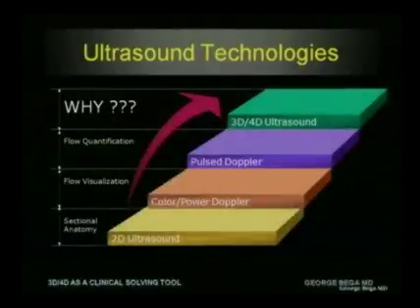First, everybody has been familiar with the fact that 3D ultrasound is a relatively new technology. We've had 2D ultrasound for years now. In the 80s, color and power Doppler as well as pulse Doppler were added to our normal clinical tools. Then recently 3D, 4D ultrasound have been increasingly used and contemplated to be used in clinical practice.